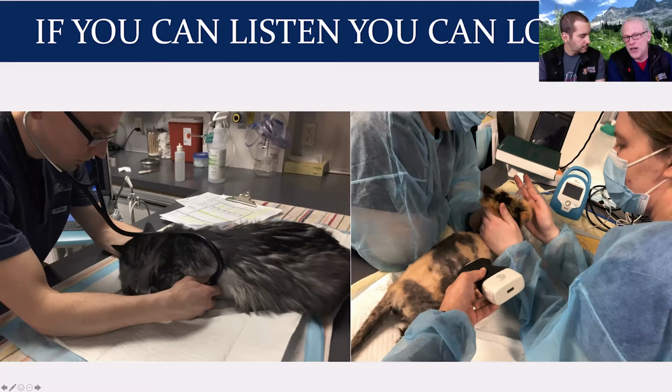They've got the oxygen on this cat here because it came in for respiratory distress. You can see that. We're reaching in. There's no cords in the way. There's no length of stethoscope. You're not restrained by having to have your head in close by the length of that stethoscope. You're actually reaching in. You've got your phone or your iPad in your other hand. No interruption, stabilization. So this is a really nice application of that point of care ultrasound that we can do in the clinic setting now.